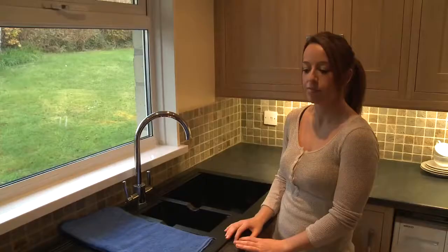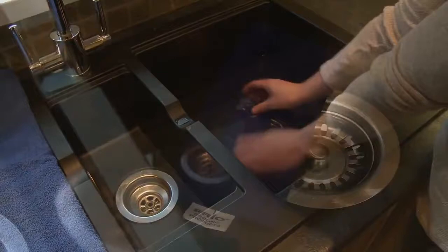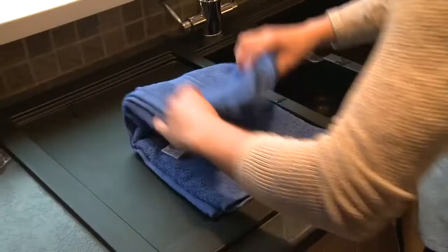To activate, simply immerse the inner wallet in water for the time specified in the instructions. This time will vary depending on the size of the wallet, but it could be up to 20 minutes. You will notice the panels will expand. When the panels have completely expanded, the wallet is taken out of the water and pat dried with a towel.